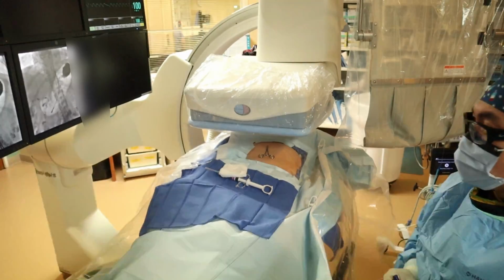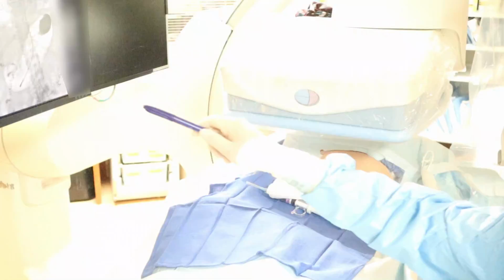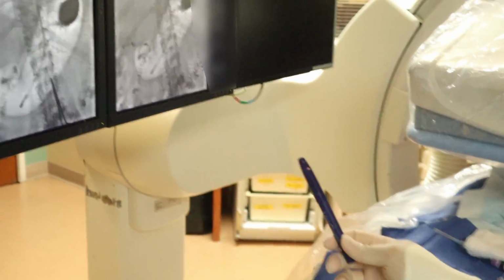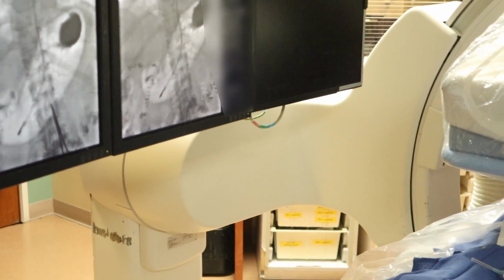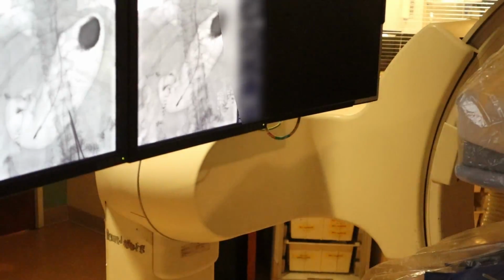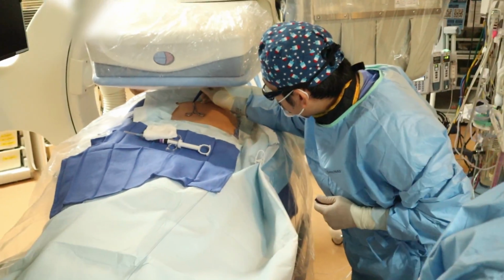We're going to get a marker. It's getting there. We want to access the stomach at the level of that duodenal C loop, right? At that parallel line, just to have optimal access. Okay, we're done with the insufflation for now. This is our G-tube site.